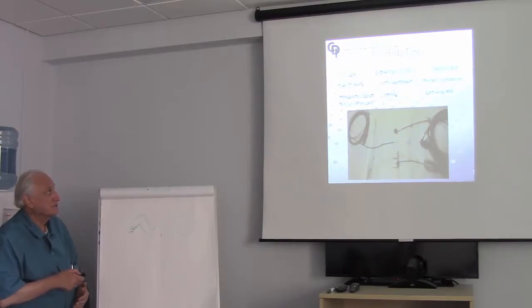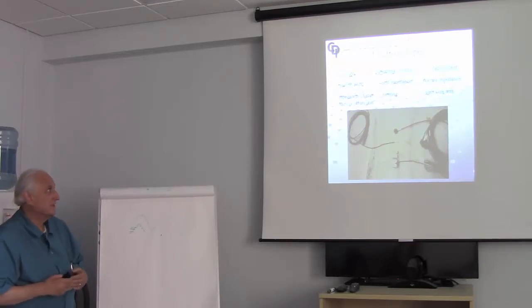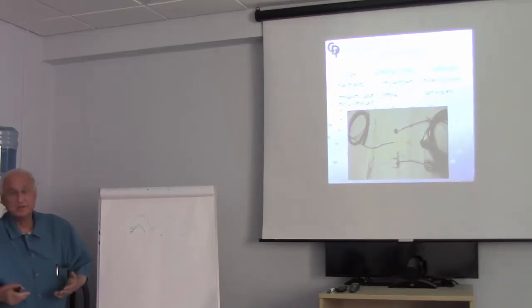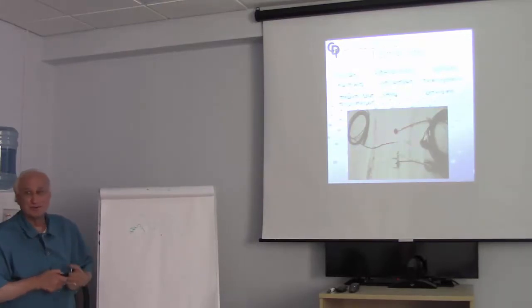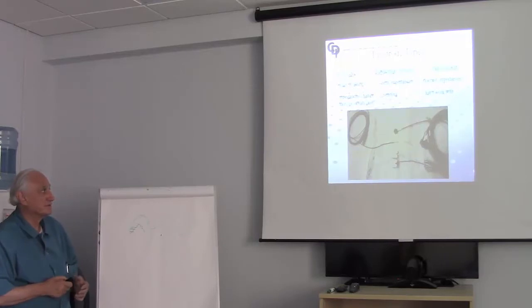Some people like pads and stickers. Again, they don't have good impedance properties. They don't match well with the impedance of the skin, and they don't really work well if you've got sweaty or hairy skin. So I'm an advocate of subdermal needle electrodes, and I think it's the way to go.